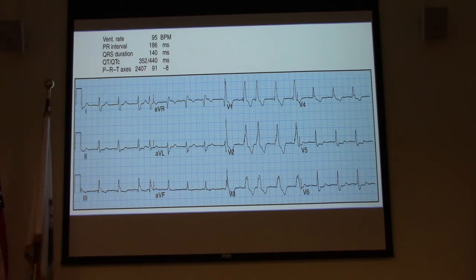Let's go back to this right one here for just a second. I can go on to say I have a normal axis. That's pretty normal. So this patient has a right bundle branch block. I could probably say that they may have some respiratory issues. They're pretty asymptomatic other than that, but overall this patient should be pretty stable.